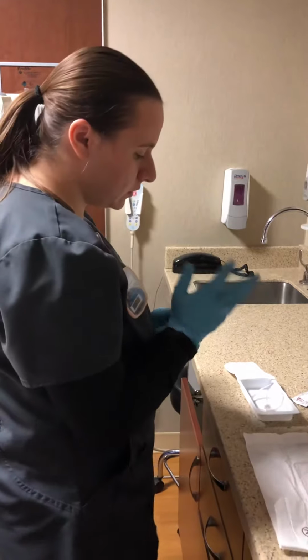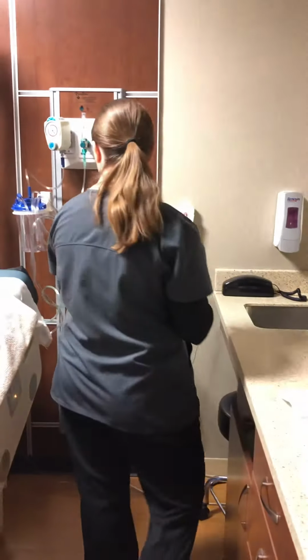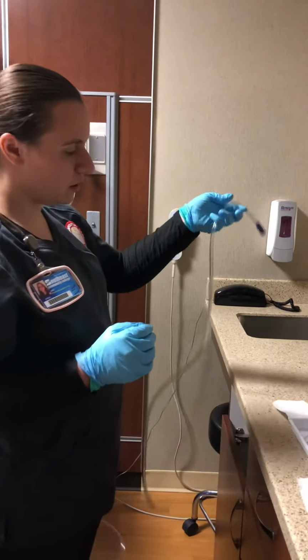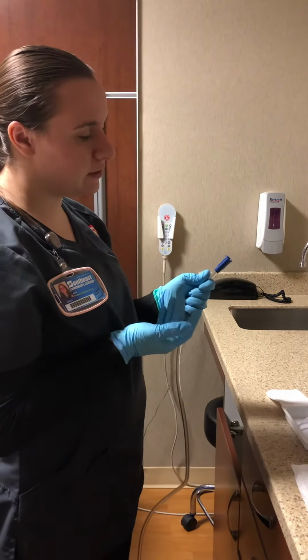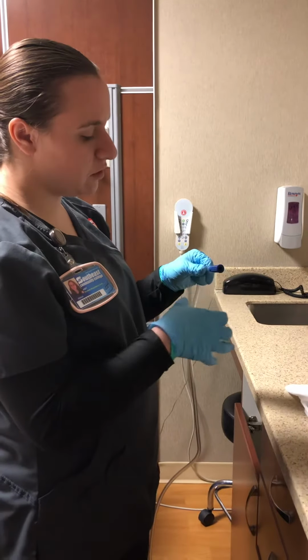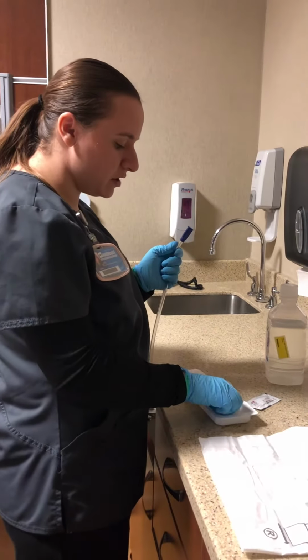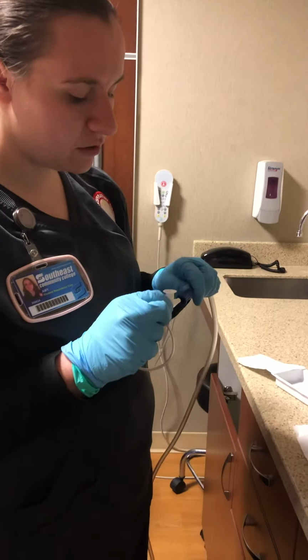Like that. So when you're ready, then we will get everything prepared. I go ahead and grab my suctioning tube in here and always make sure there are no kinks, no twists in it or anything. And beforehand, if the doctor needs a sample, I can always place on a little suction catcher, a little thing that you can catch in another cup for the lab. Since I don't need that, I'm going to take my sterile hand, my right hand, and place the catheter into the suctioning tubing.